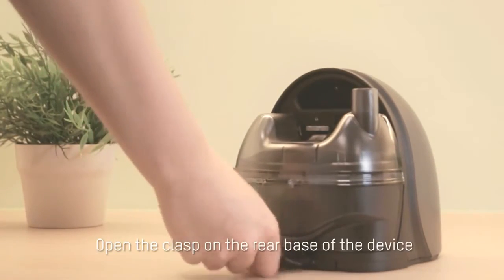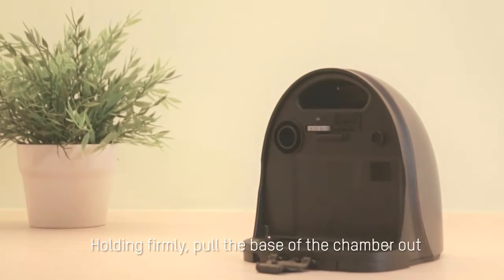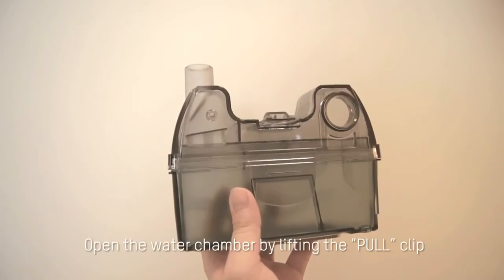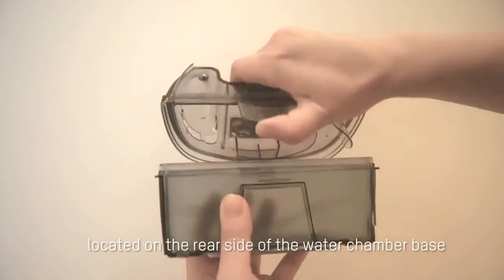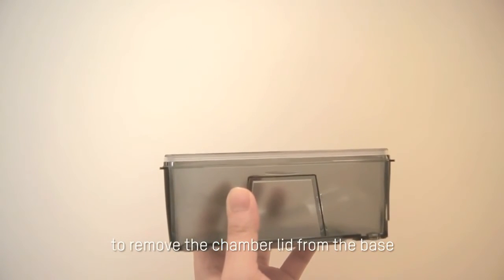Open the clasp on the rear base of the device. Holding firmly, pull the base of the chamber out from the bottom to free it from the unit. Open the water chamber by lifting the pull clip located on the rear side of the water chamber base to remove the chamber lid from the base.